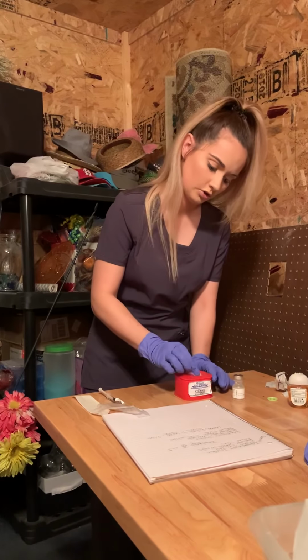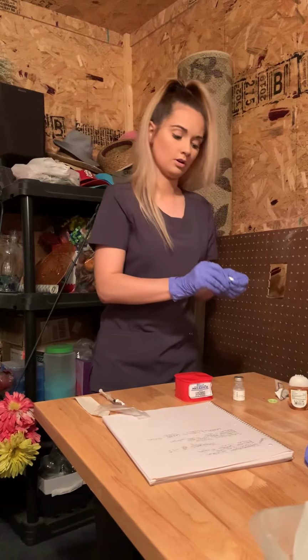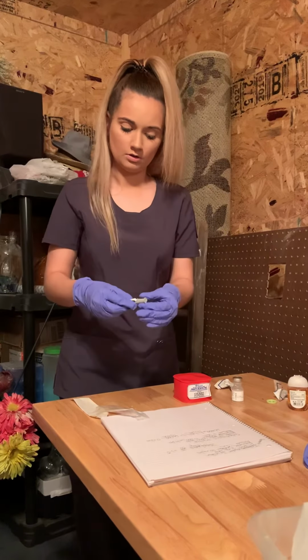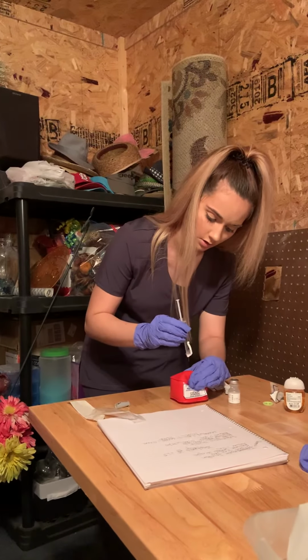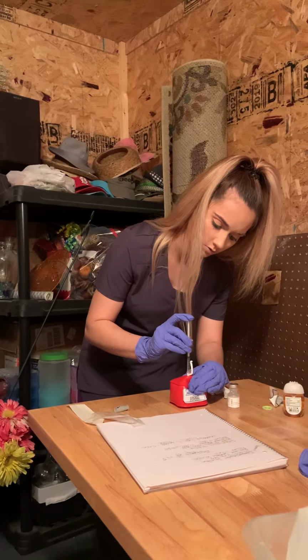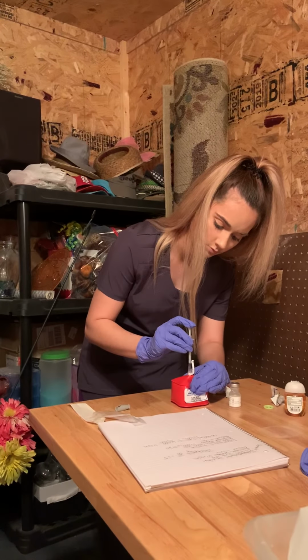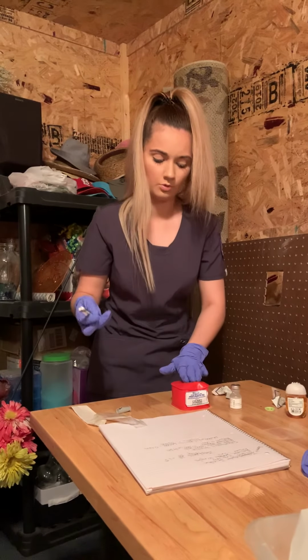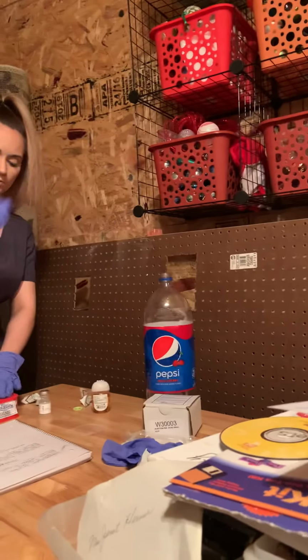To clean this side, you want to start in the middle and go out at least 2 inches. You take your gauze or alcohol swab, put it between your fingers of your non-dominant hand. You will want to uncap the needle, pinch the skin, go at a 45 degree to 90 degree angle, and insert the medication slowly. After that, you'll put the alcohol swab or gauze over, engage the safety in your sharps container.